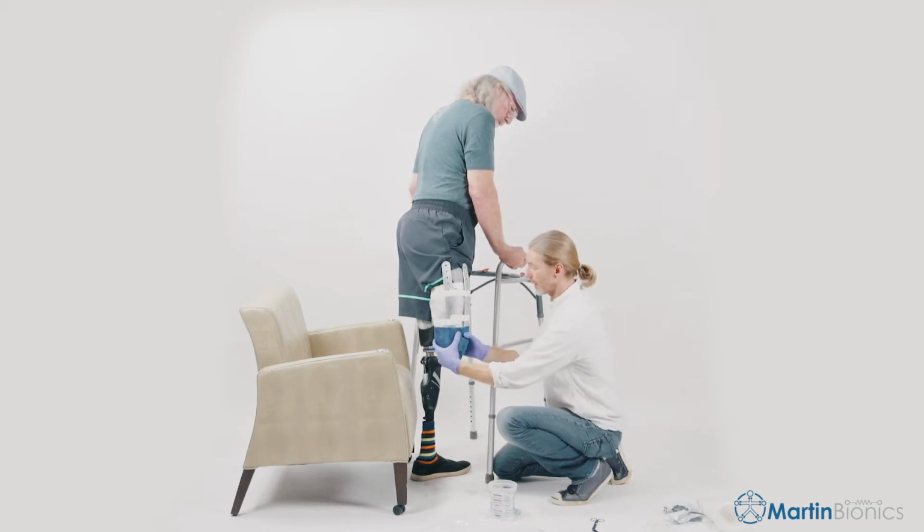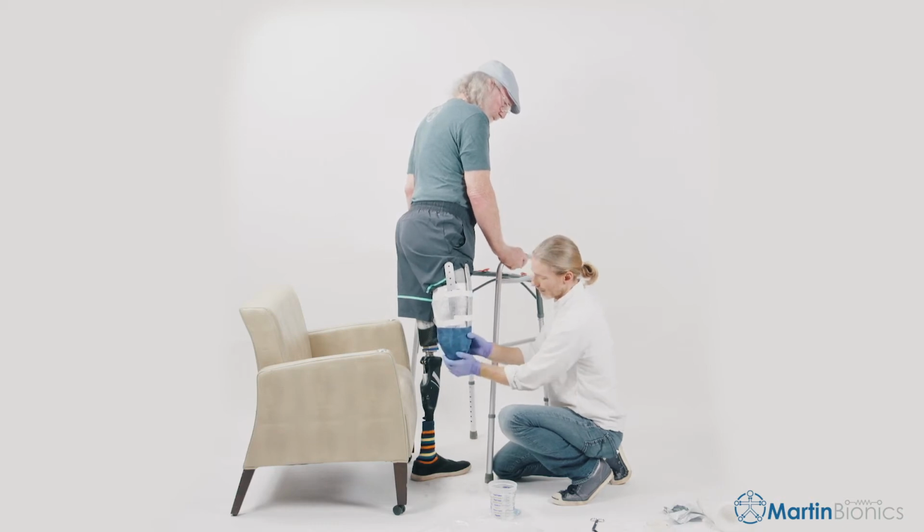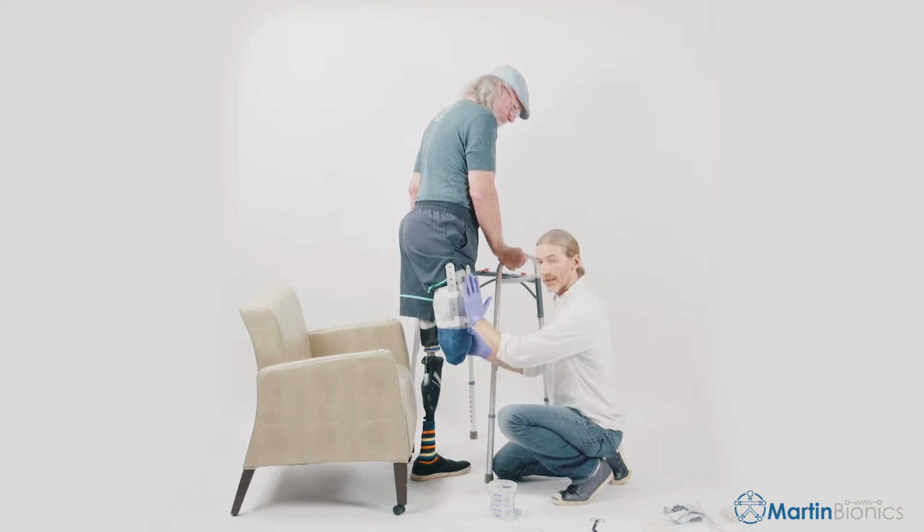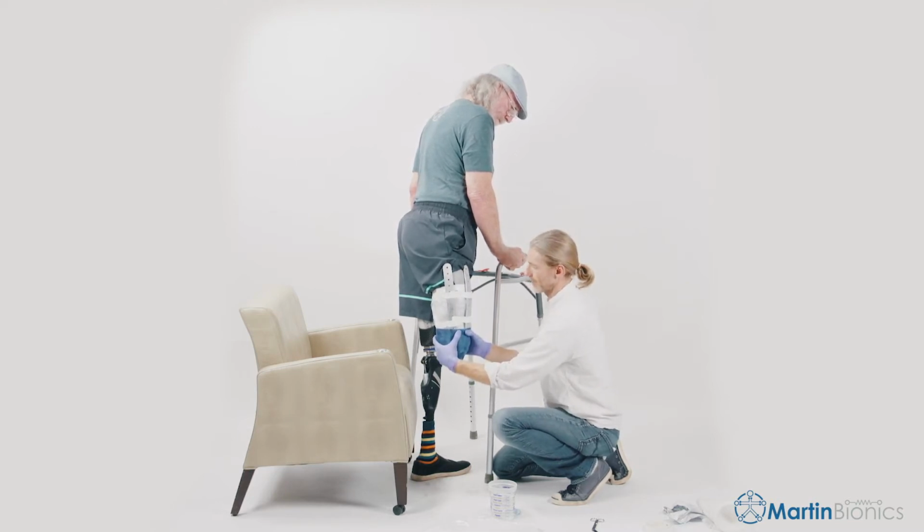As I'm smoothing in the fiberglass wrap, I'm also just slightly holding the struts against the limb so they sit as contoured to the limb as possible. So a little bit of pressure, make sure that stays contoured right, nice to the limb shape.